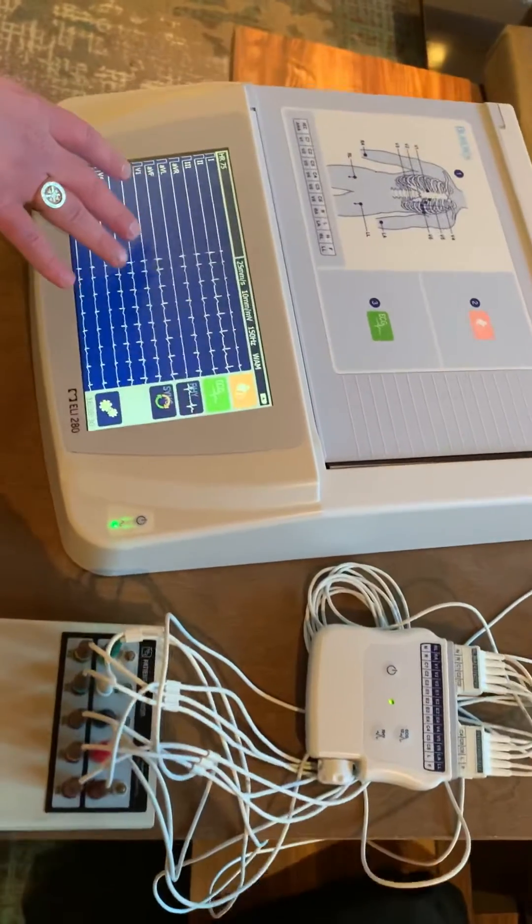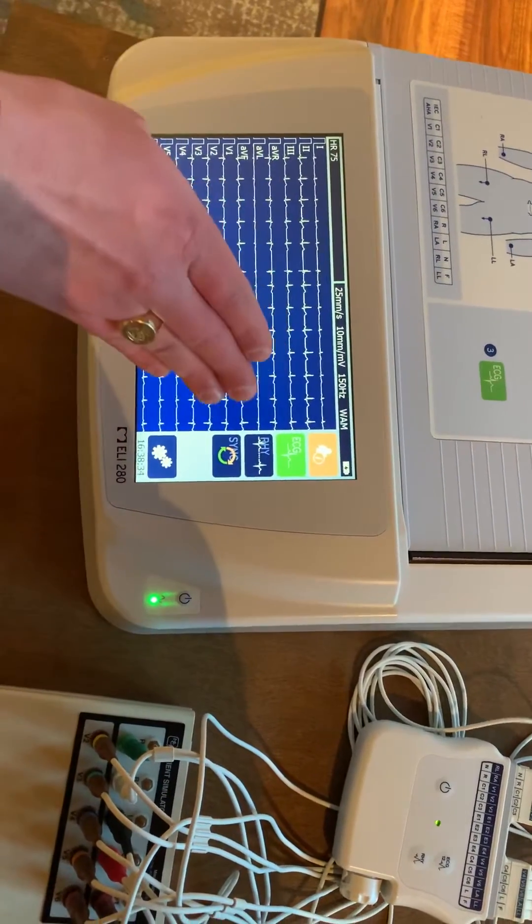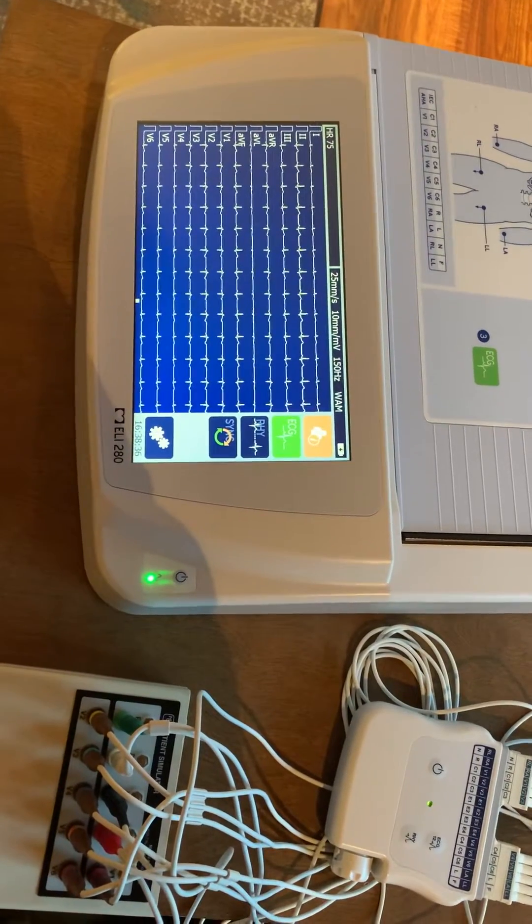Once there's electroactivity that is picked up, you will see the tracings on the 12 leads on the top of the screen, and it will start to show.